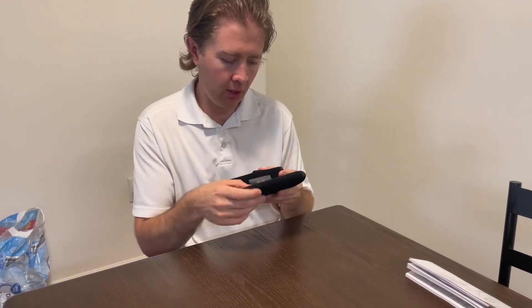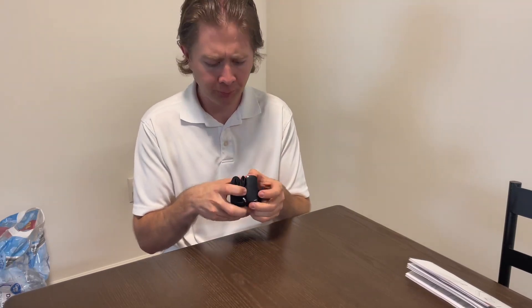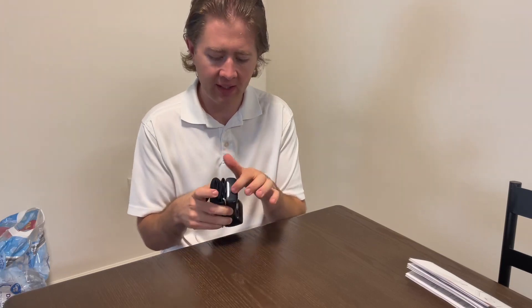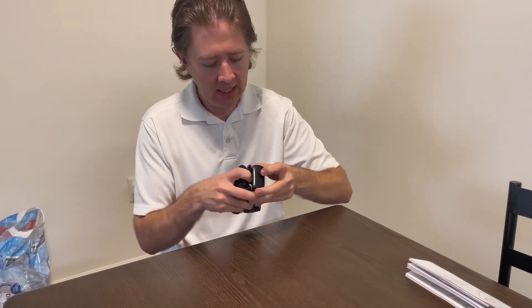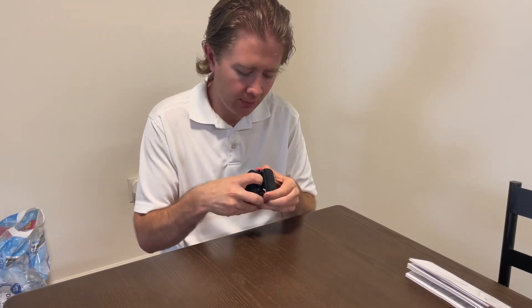Also just know that it's not rechargeable — it does not have a lifetime battery or anything like that. When you receive this, there will be a little tag that you have to pull out to let the batteries touch the contacts. There's a little lever — it's sort of difficult to get to, to be honest with you.